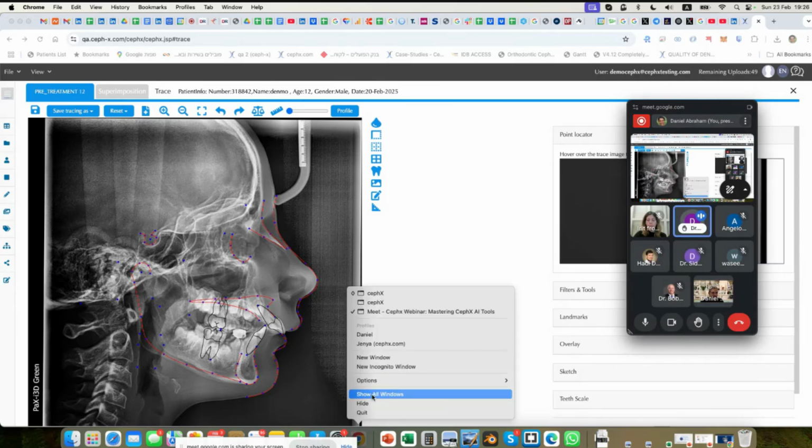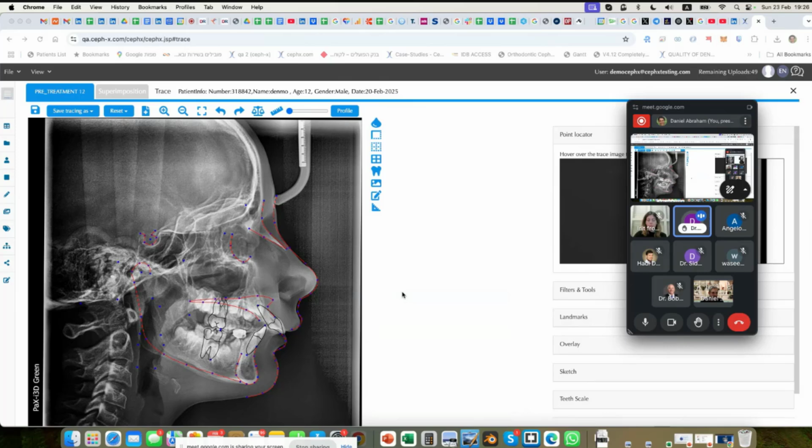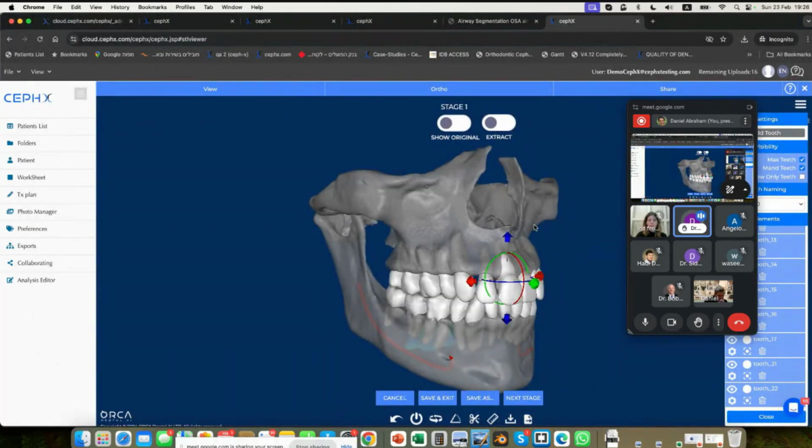Hello, thanks for your presentation. I wanted to know how you upload the CBCT file to this software.